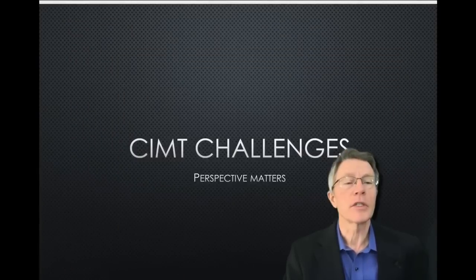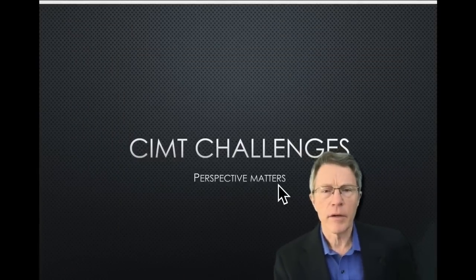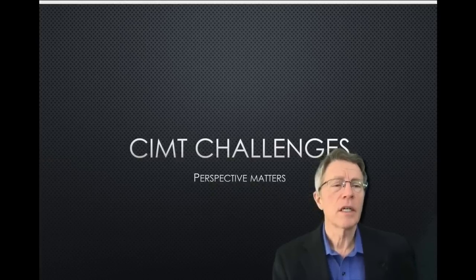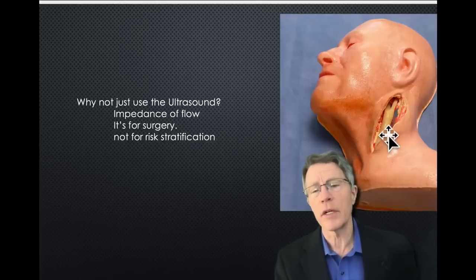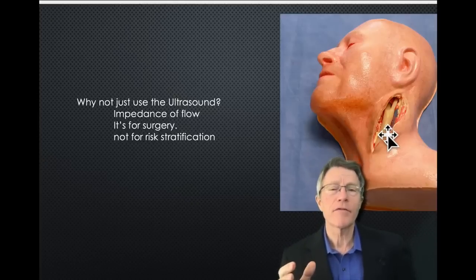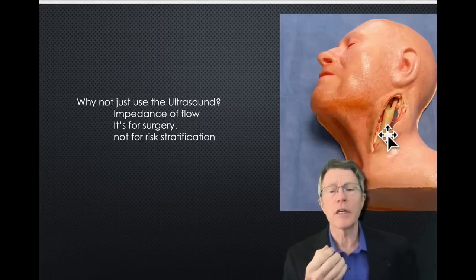So I had another patient come to me just yesterday with a carotid artery ultrasound. That really doesn't help the vast majority of us. All it is, what we call a flow study. It's looking to see if the plaque inside your carotid artery impedes the flow. Well, you have to have about 50 to 60% of the lumen covered up in order to impede the flow.